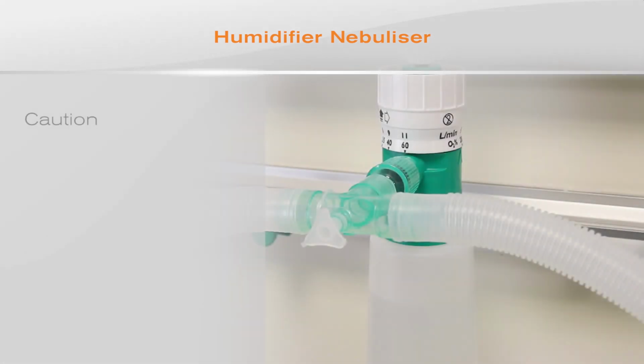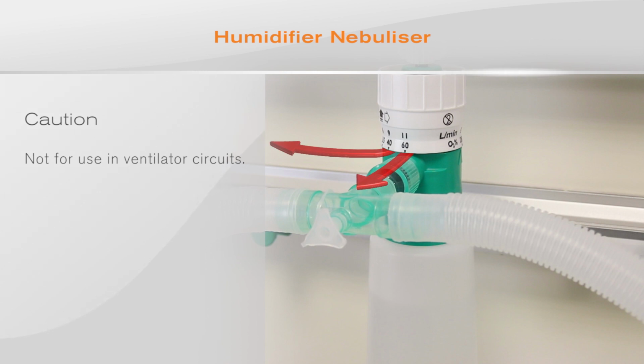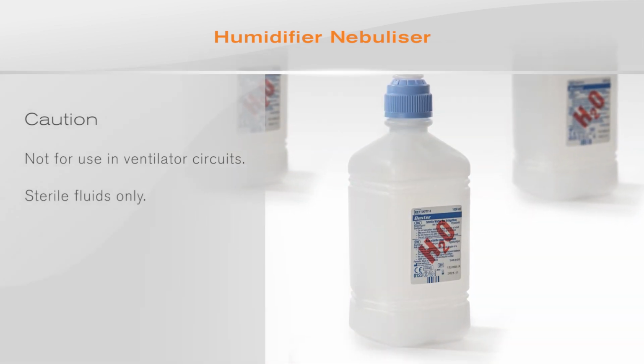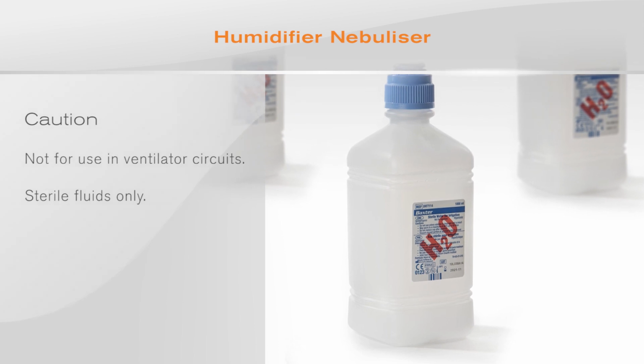These devices should not be used in ventilator circuits, as the air entrainment port will introduce a leak into the system. These devices should also only be filled with sterile fluids.